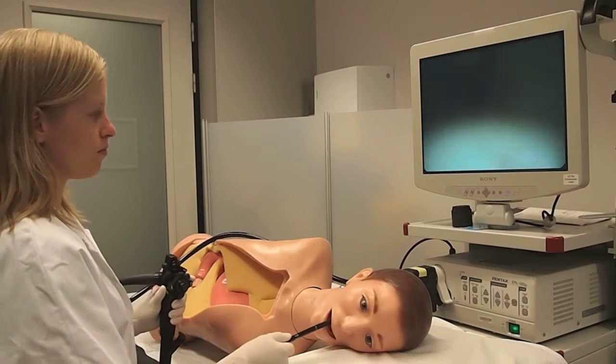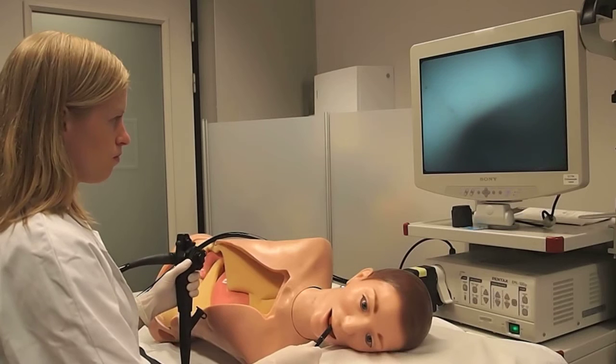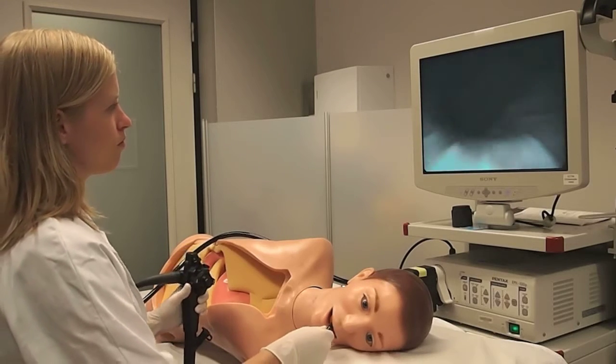Flexible endoscopy is a minimally invasive procedure which allows the physician to examine the internal body cavities using a flexible endoscope. The physician uses the wheels on the control handle to control the movement of the tip, which contains the camera.